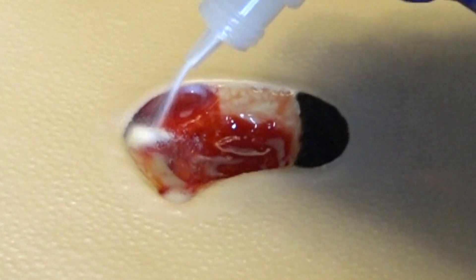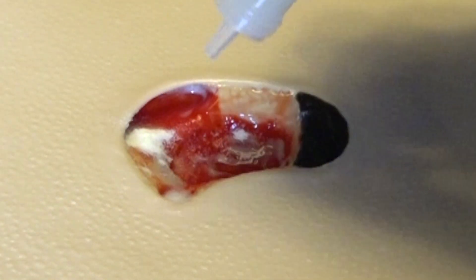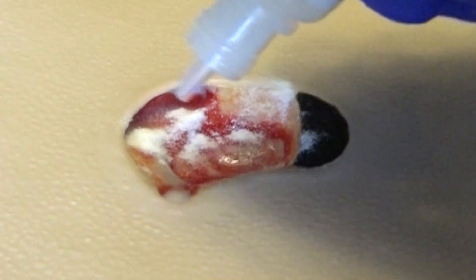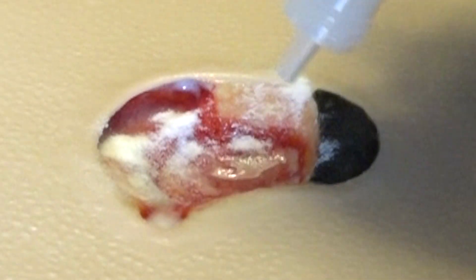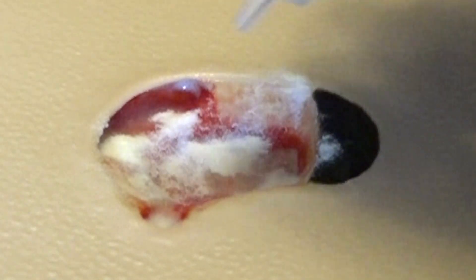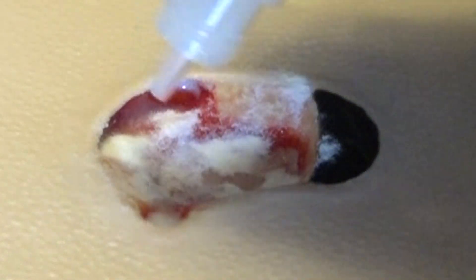Next, put on a clean set of gloves and apply the Hi-Col hydrolyzed collagen powder onto the wound bed. Be sure to cover the entire wound, wound edges, and any areas of tunneling or pockets. Be sure to put Hi-Col in contact with every part of your wound. The ideal application is an equal layer of thickness across the wound bed.